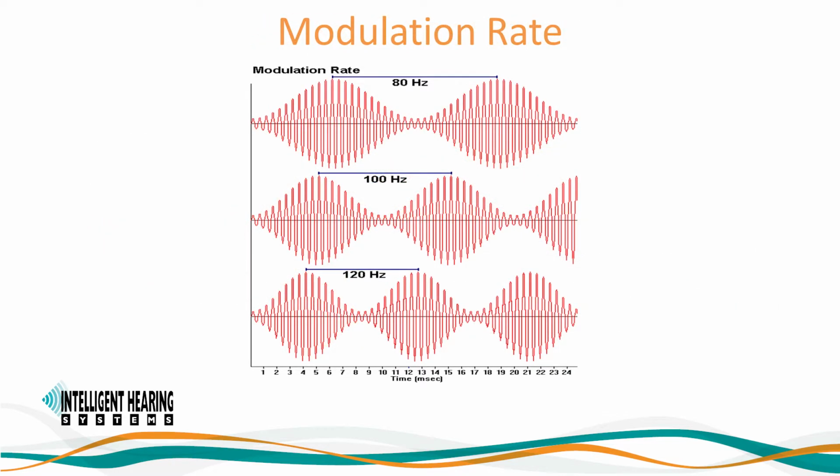Modulation frequencies from 20 to 120 Hz can be used. In practice, the best results have been obtained using modulation frequencies above 70 Hz. These faster rates of stimulation produce responses that have larger contribution from the earlier ABR components, therefore making these modulation frequencies less susceptible to being affected by patient state. And the use of these allow patients to sleep without affecting the responses.